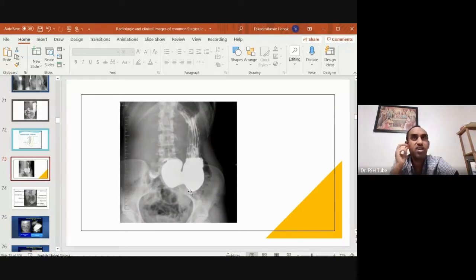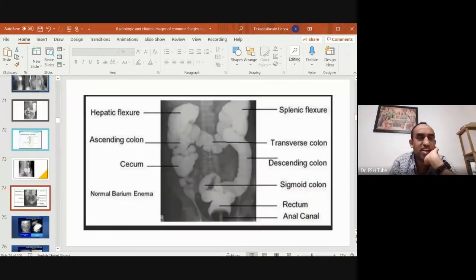There is a condition known as stomach ptosis or something like that, if I am not wrong. Just Google it and double check. I think it's called gastroptosis, yes. The stomach would be hanging into the pelvic cavity. The other case is if a patient has a long-standing GOO, sometimes the stomach will be distended and could be pelvic reaching. So patients with gastroptosis may have a pelvic reaching stomach like this one. These are rare, but don't worry about this.